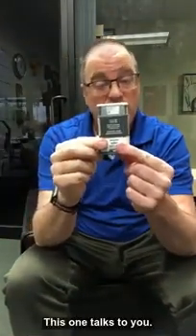Now this one is pretty cool. This one talks to you. It's called an Auvi-Q. You just pull the top out and listen to it.